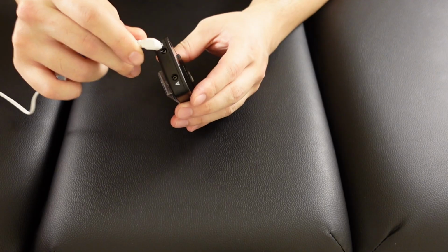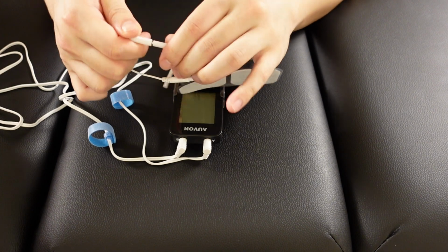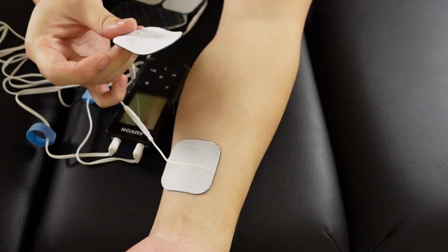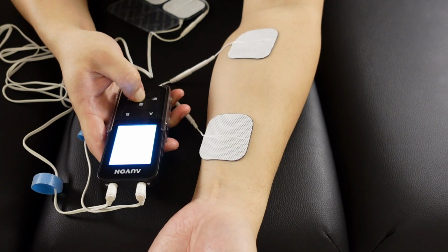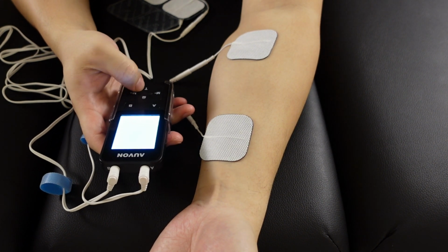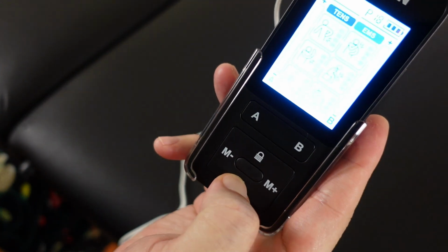So now that we've gone over all the mechanisms, research, and uses, let's go over how we can utilize electrical stimulation to address our pain. You're going to start off by grabbing your stim unit and attaching all the cables and stim pads to it. You are then going to apply the stim pads to the skin in the areas that you want to address. Once you've got that all set up, you can go ahead and turn on your unit, and luckily with the modern types of units, you don't have to manually address each setting, but rather choose the type of electrical stimulation that you want to use.